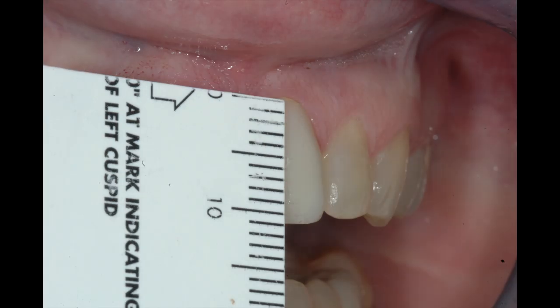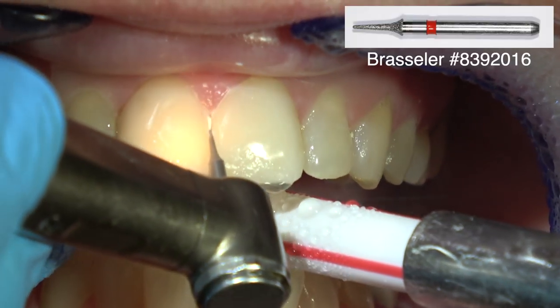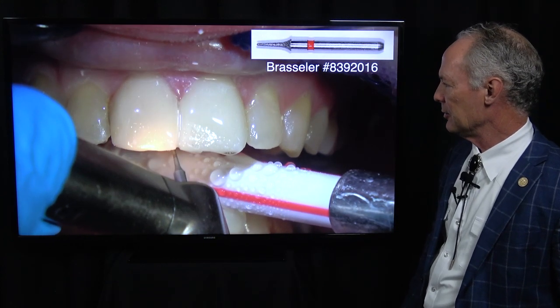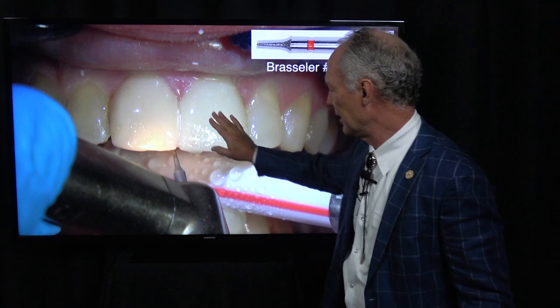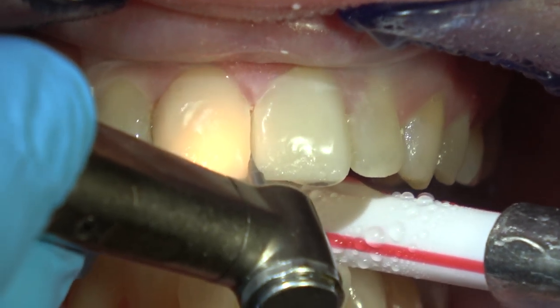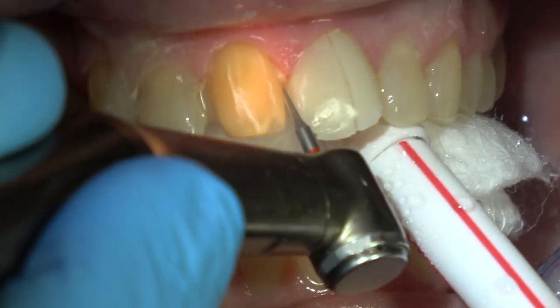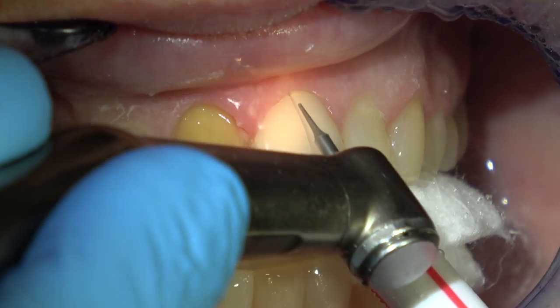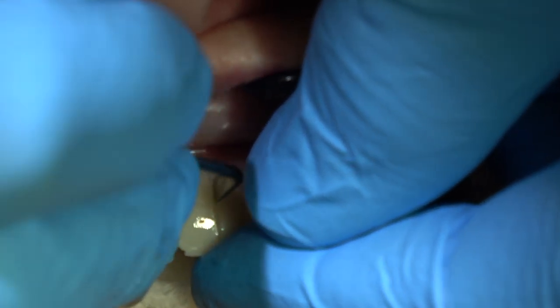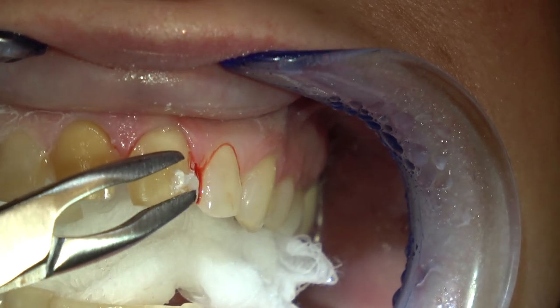We're about 11 millimeters — that's perfect. We're going to anesthetize the teeth with the painless and profound injection. Then I'm going to use this mosquito diamond to cut between the veneers so I can torque them and they'll come right off. You'll notice where the etch was, that part is not going to pop right off. Sometimes you've got to prep that a little bit. That's why you don't want to get that etch all over the tooth when you're seating provisionals — you might have to reprep the whole tooth.